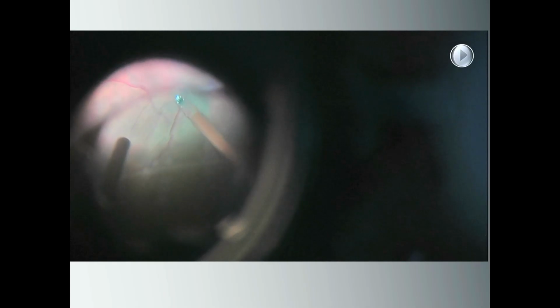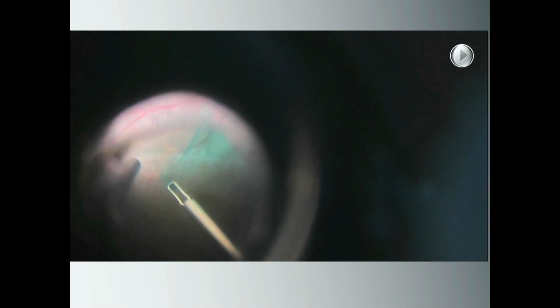So this is what I was saying. You can see the fold as it goes through the macula. So again, as I said, peeling. This is green, but actually it's the camera. It's dual blue. It's obviously not ICG.